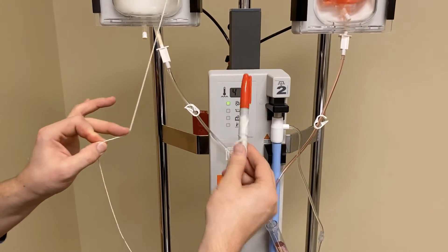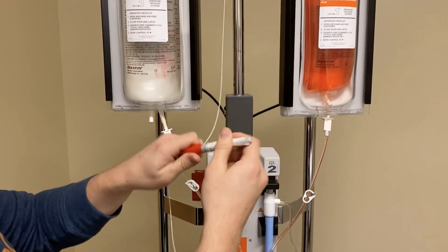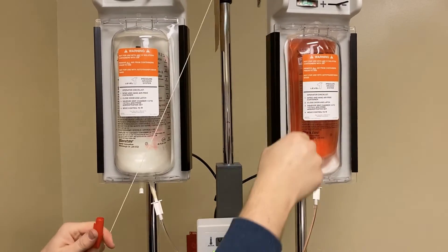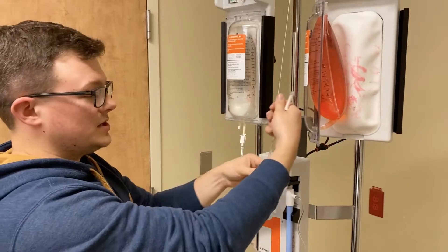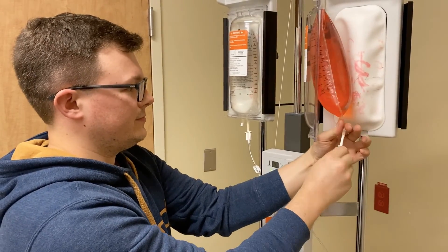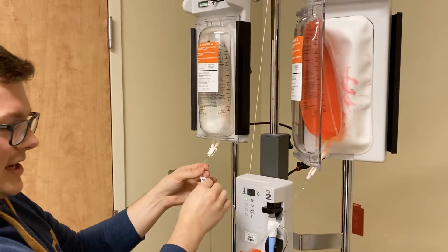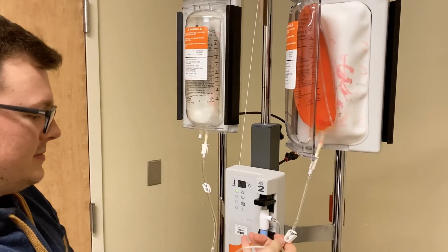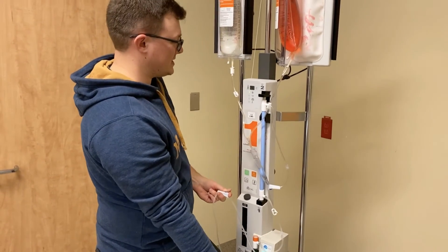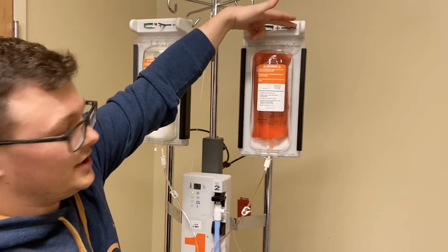In our department we keep a marker tied right onto our Level 1, so as we're putting up blood, before you even put it in the system you can mark which unit it is — if it's your first unit, just a big '1' on the bag so you can keep track. Make sure this side is clamped, spike your blood, double-check the other side is clamped, then unclamp this side. As soon as you open up the system again it'll start infusing. Close it up and you're ready to go.